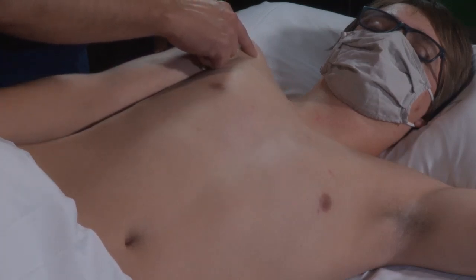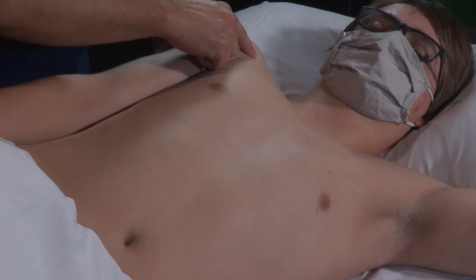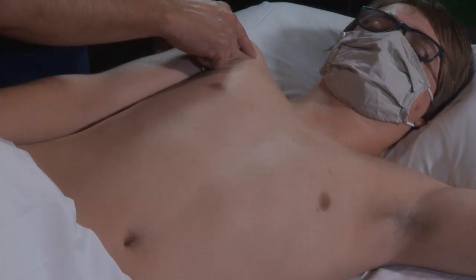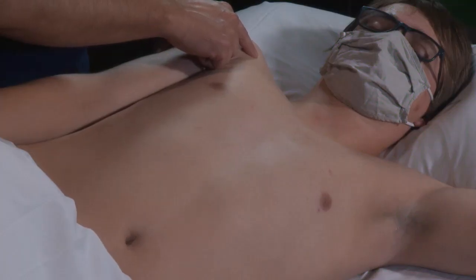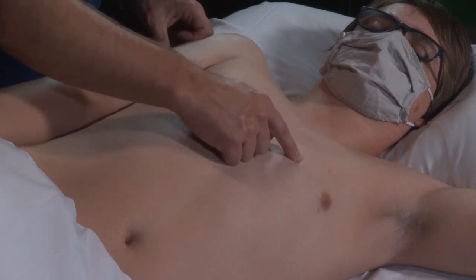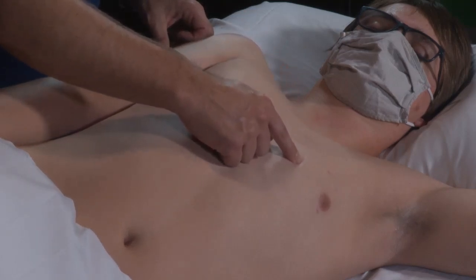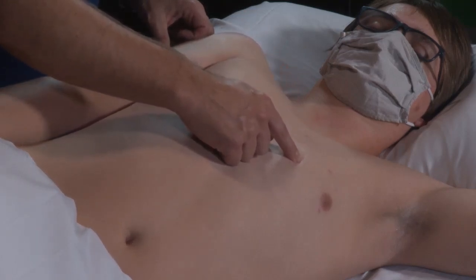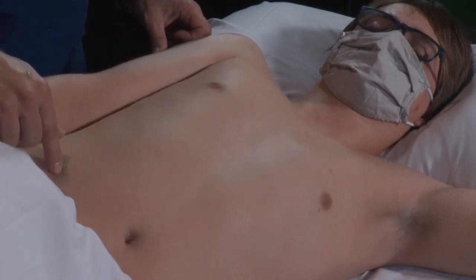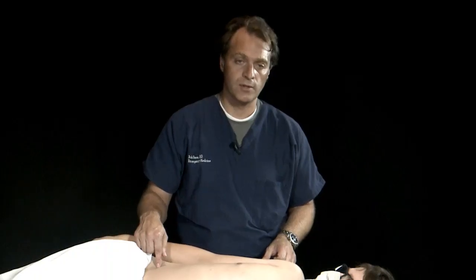After we've obtained our parasternal long axis view, we'll be ready for our parasternal short axis view. To obtain this, we're going to keep the probe in the same location and rotate 90 degrees so that we're pointed towards the patient's right hip. That will be our parasternal short axis view orientation.